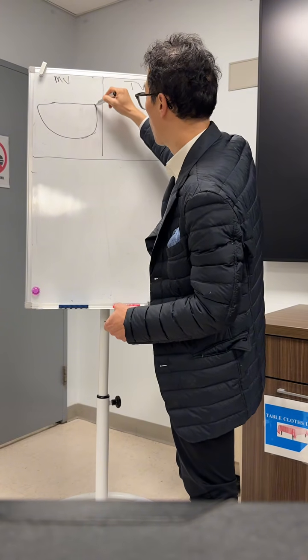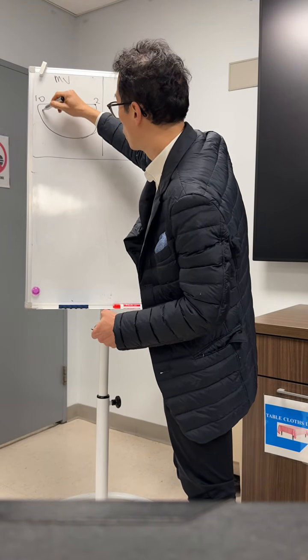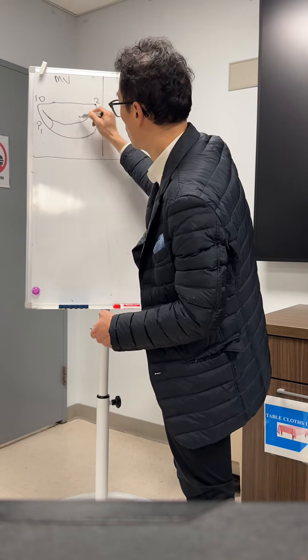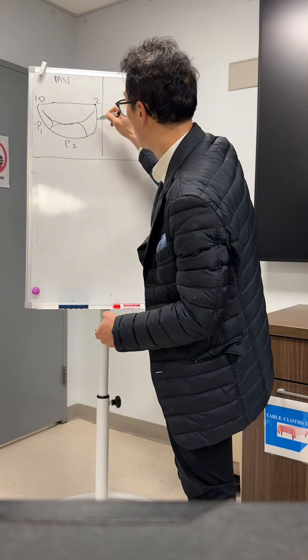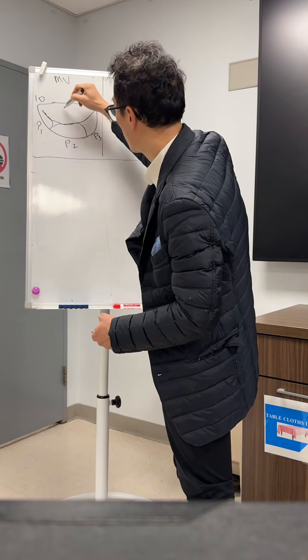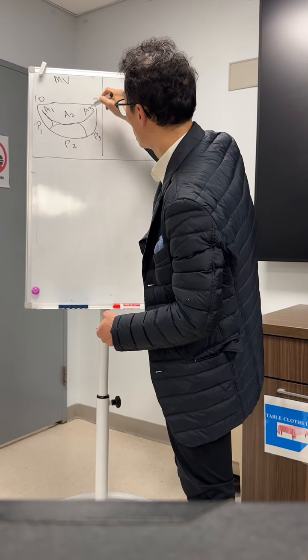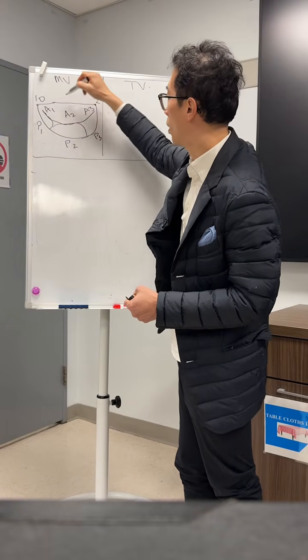So the commissures here, I usually go 10 and 2. Mitral, as you know, is a smiley face, right? And then we have P1. Let's say this is P2. And this is P3. And of course, there's matching segment here, which is A1, A2, and A3. Okay, so it's very important for the commissures to be here.